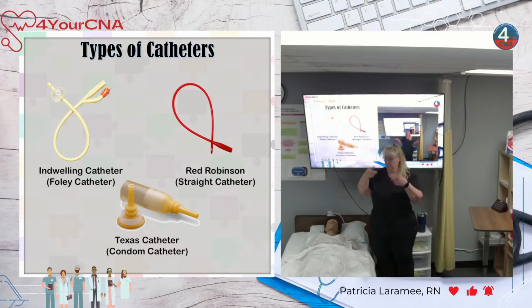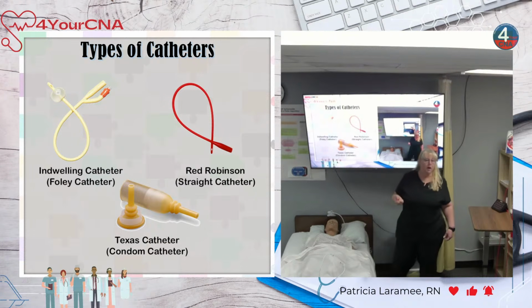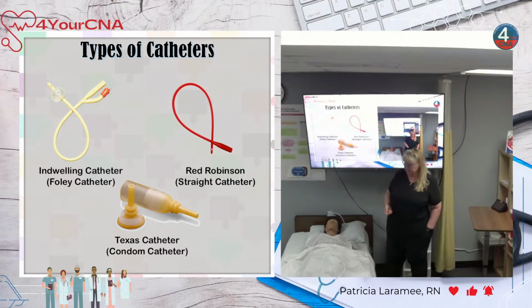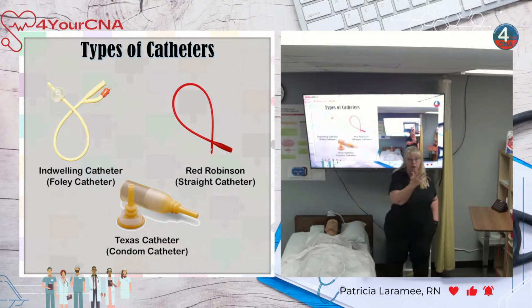because there's no bubble. Why would they use one like that instead? If we have a patient who went through surgery and has not peed after we took their catheter out, and we waited, and it's now been 8 hours. We've been pushing fluids and nothing has come out. Well, that's a problem. So I need to find out how much urine is actually in there. How much are you retaining?